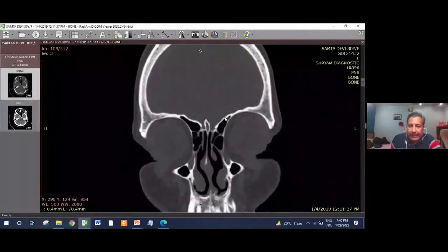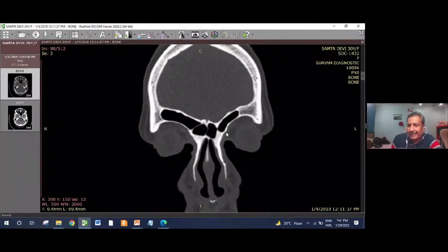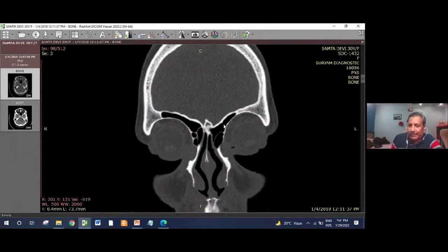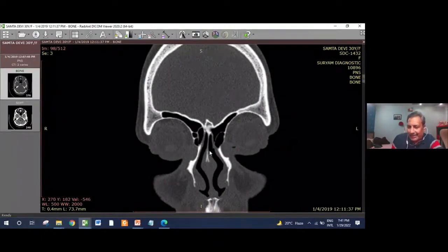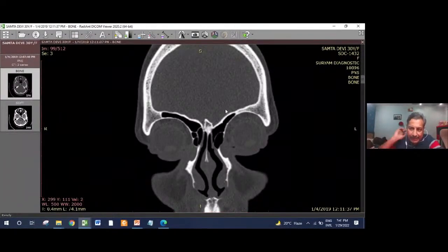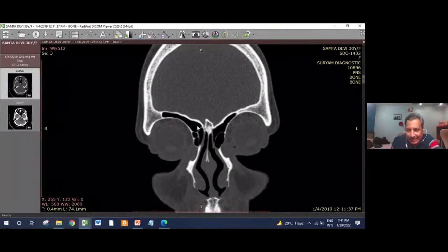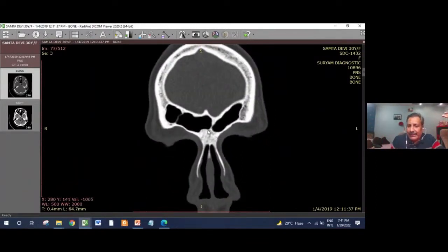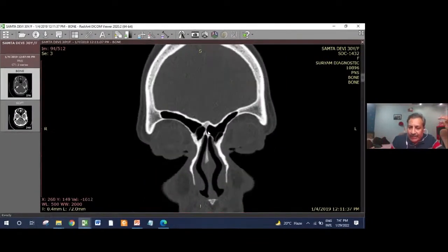Now see, in the frontal sinus, when you go behind, the frontal sinus is over and the frontal recess starts. See this, the cell which is pneumatizing above the orbit. One can easily get confused with the frontal sinus, but this is not frontal sinus. This cell is above the orbit. The frontal sinus we have already left anteriorly. We have come, see, this is frontal sinus anteriorly. We have gone behind. This is frontal recess.